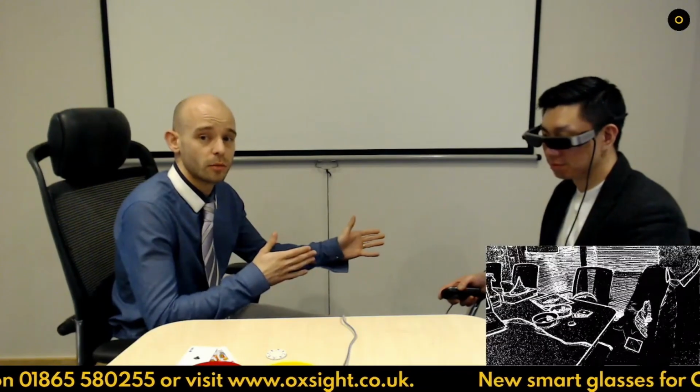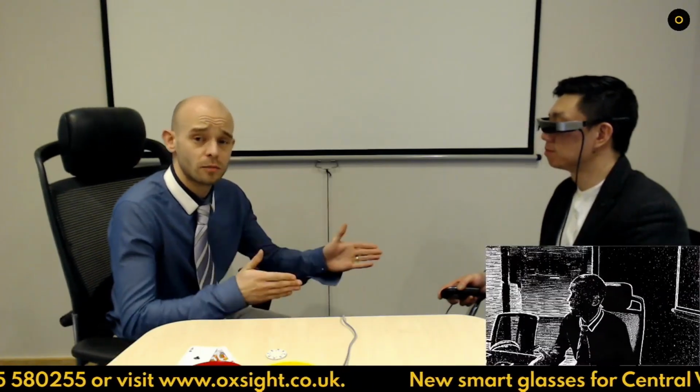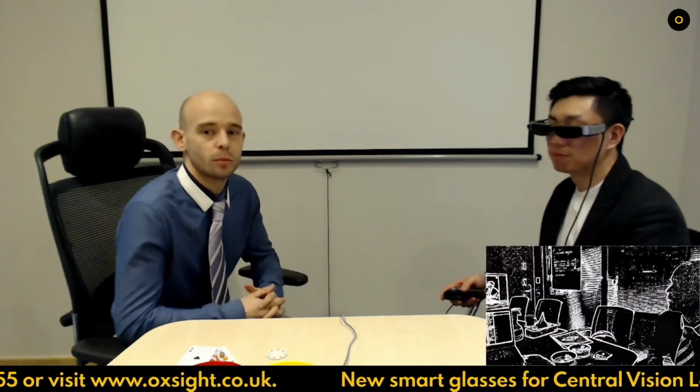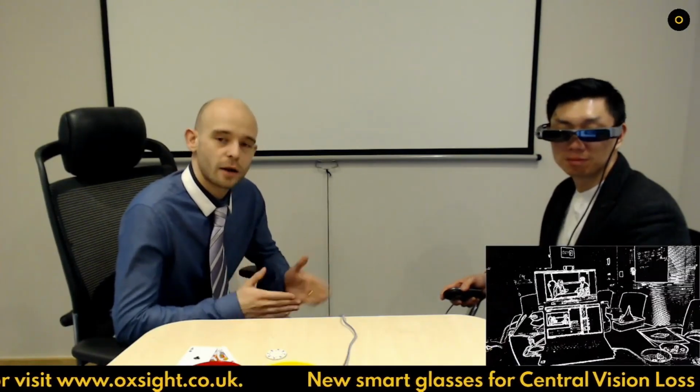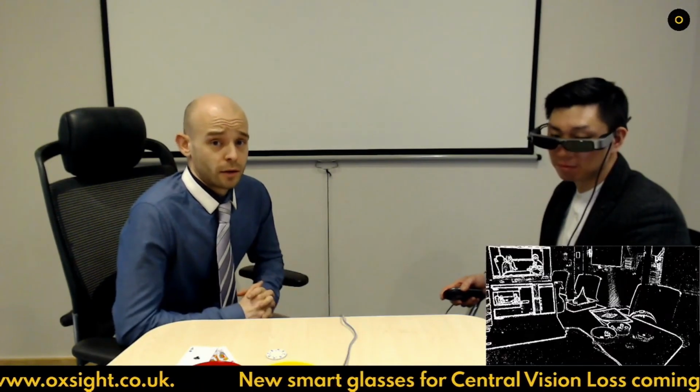But the most important thing about this is you can notice where objects are. So as we said about the other mode a moment ago, if you can't do it in that mode because the contrast is difficult, you can turn it to this mode where contrast isn't so much of an issue, because it's already put in the contrast there for you, with a black background and a white highlight around it. So really good for that kind of thing.